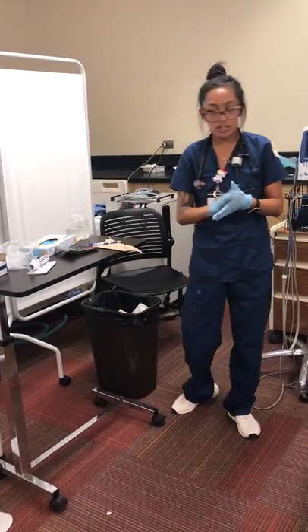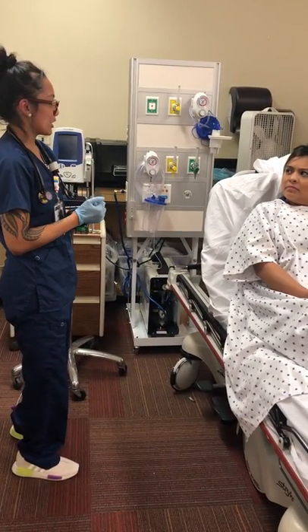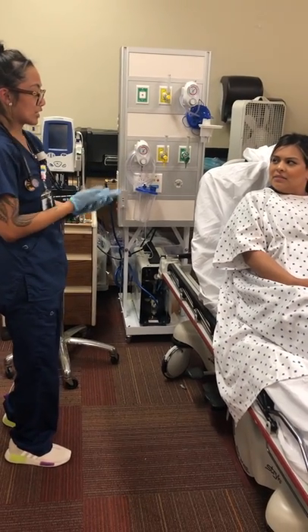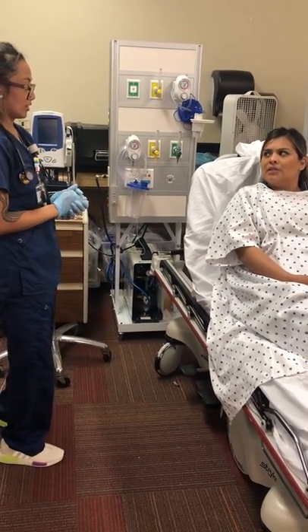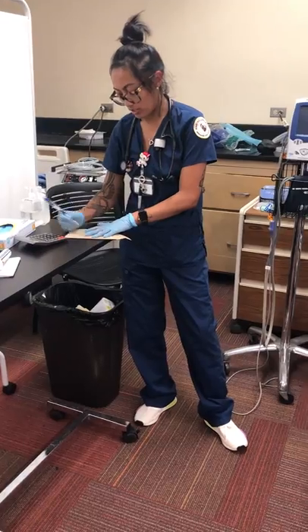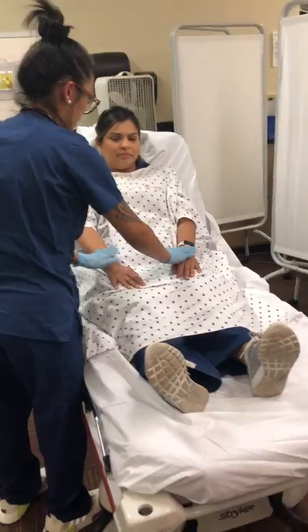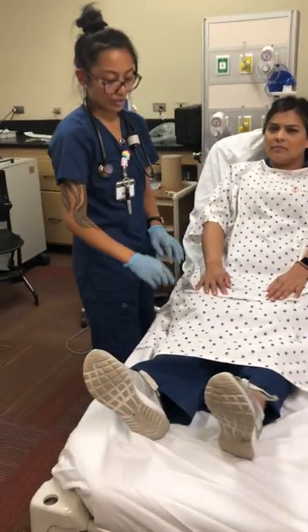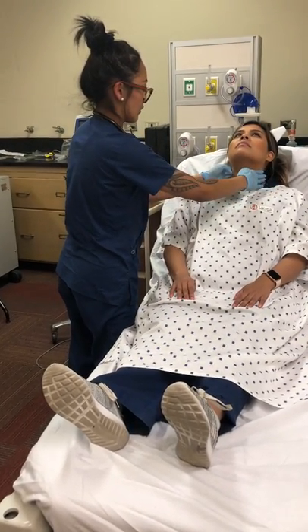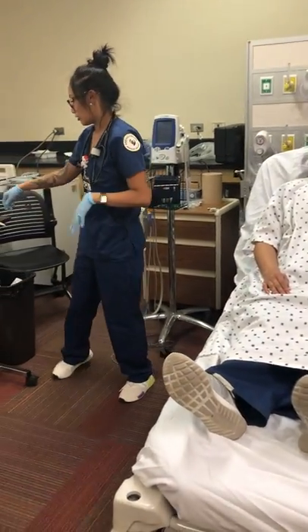Are you having a hard time breathing right now, or are you okay? On a scale of 0 to 10, zero being fine and 10 being you can't breathe — where are you? Zero. So I'll write down zero dyspnea. Her skin is warm to touch again, with no sign of cyanosis or discoloration. No pain when pressing down around the neck area either. So no discoloration.